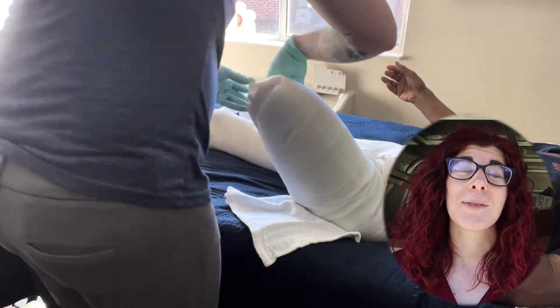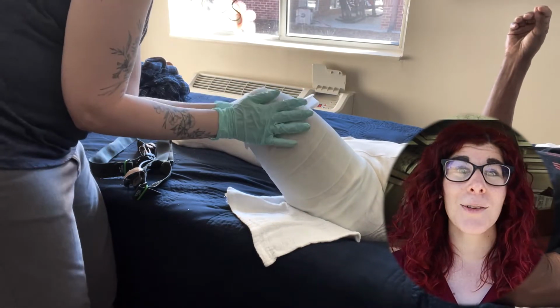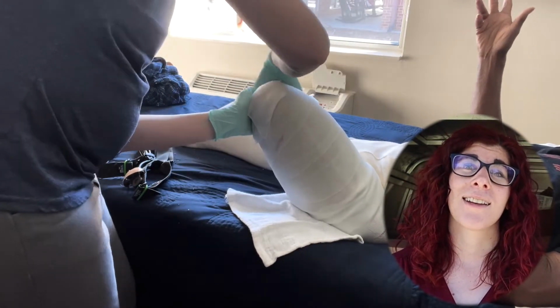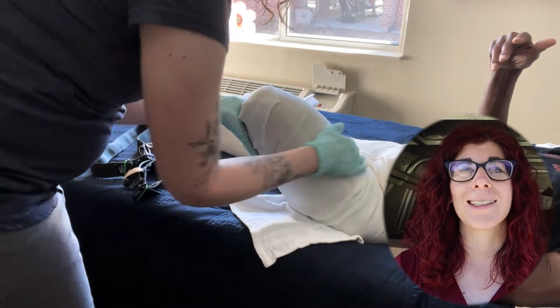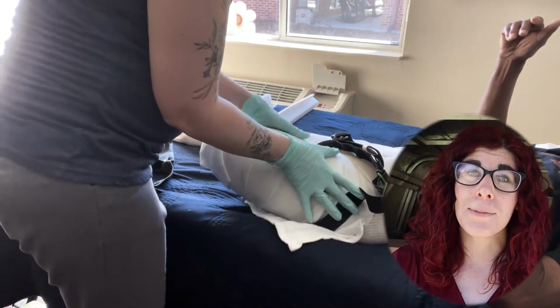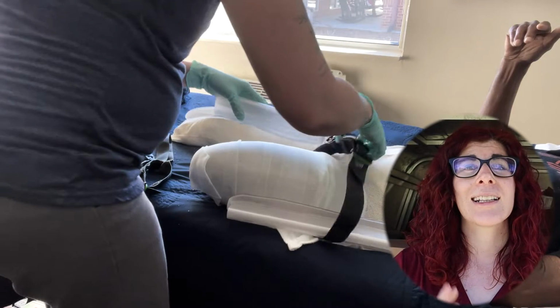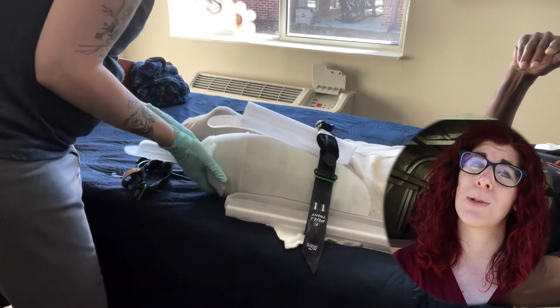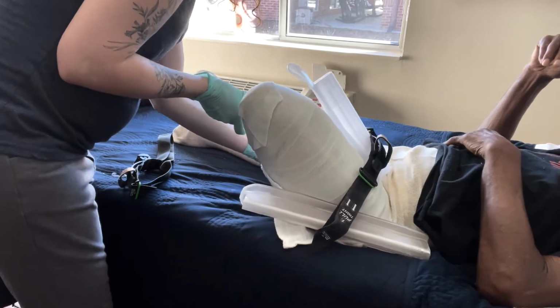Now, I hope it is obvious to you that this patient is bilateral. He has amputations on both his left and right side. And as a bilateral patient, he's going to need a set of feet and a prosthetic knee for that left side that allows him to get back to his previous level of independence safely and not put a lot of stress and strain on his residual limb. He was living independently in an apartment, getting around on his own, doing his own cooking, cleaning, all those things on his own. And so we want to get him back to that level of independence. But for some reason, that is not as obvious to some insurance companies.